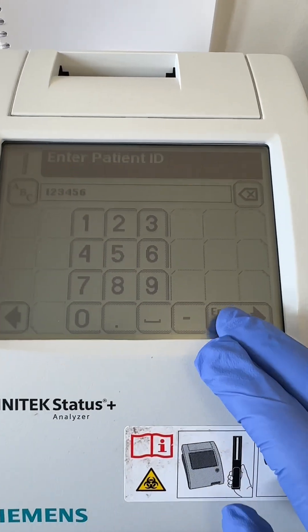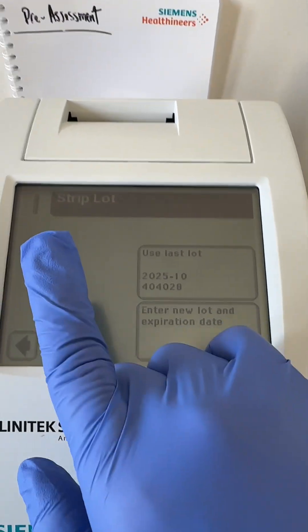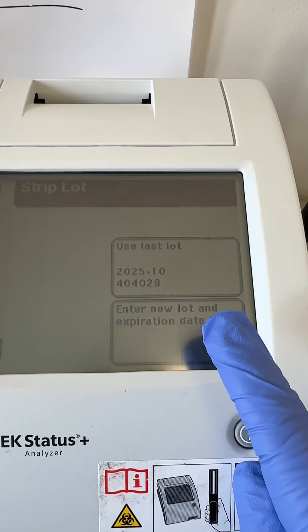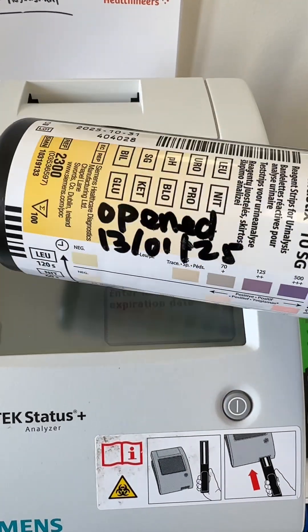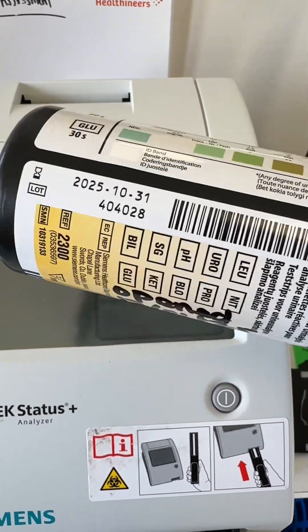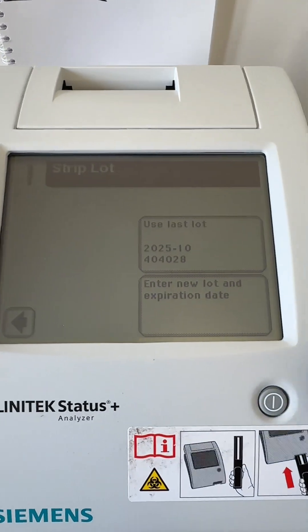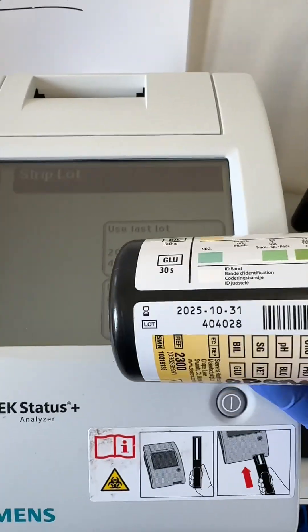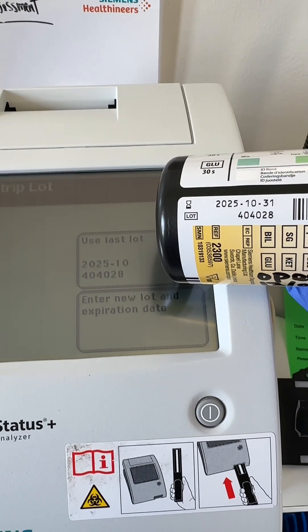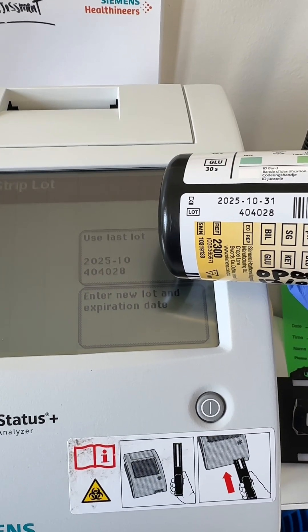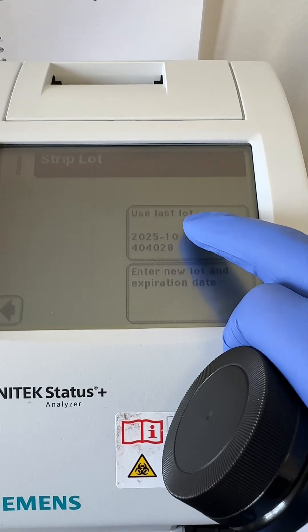Press Enter and it will show the strip lot — either use the existing lot or enter a new lot. You can scan the barcode or check the 'Use Last Lot' screen. The lot shown is 2025-31-40-40-28, which matches, so I'll select 'Use Last Lot'.